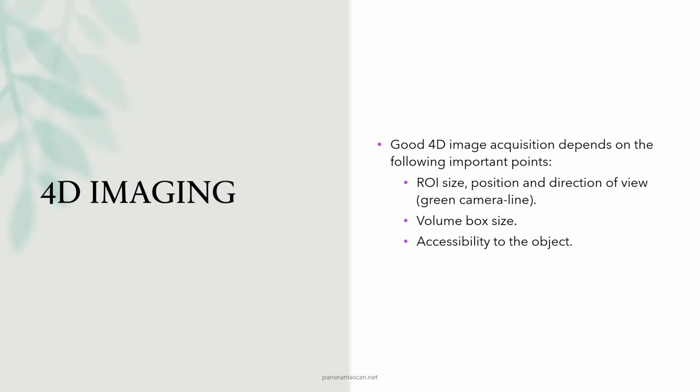Ensuring the patient is in the correct position can make a significant difference in the quality of the scan. This may involve adjusting the head, torso, or limbs depending on the anatomical area of interest. Additionally, ensuring that the abdomen is properly prepared is equally important. Adequate application of gel and ensuring the transducer is in direct contact with the skin eliminates any air pockets and improves the transmission of sound waves, further enhancing image quality.